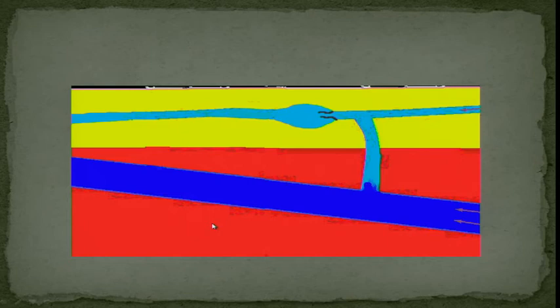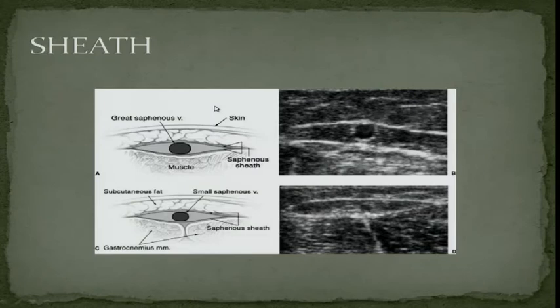Only standing up. So, examination of venous reflux: in each of our ultrasound rooms, we have a little table or a little stool, and the patient stands on the stool and the technologist sits on a chair, and that's how we scan it. In India, we would make the patient stand on the table and try to scan. I don't know why we did that, but we didn't have stools. But here we make the patient stand on the stool, and the tech sits on her chair and scans. It's a very tedious exam trying to pick up reflux and at the same time freeze that image. So give some consideration there.